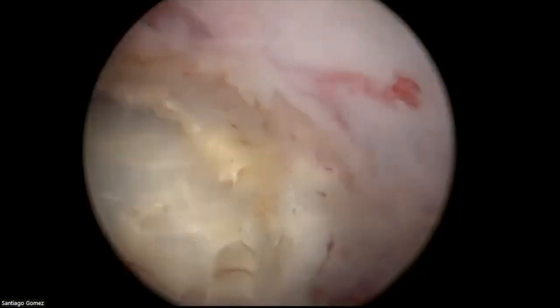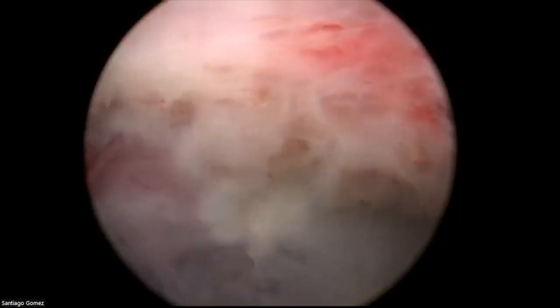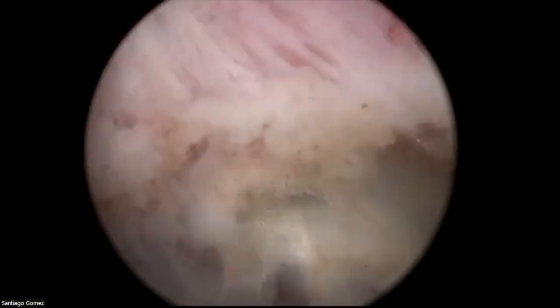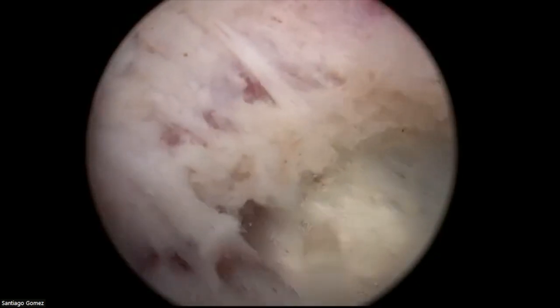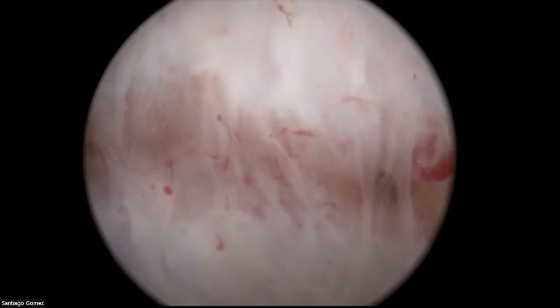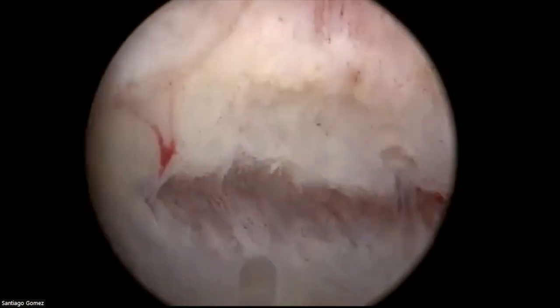So keeping the endoscope close to the tissue and keeping the fiber close to the endoscope gives me some advantage in terms of dissection. I'm not dissecting the plane mechanically. This is dissecting the plane mechanically. When I go in and push, you see, this is dissection with mechanical effort. I don't do that. I just contact.